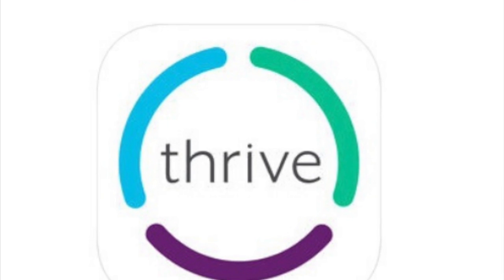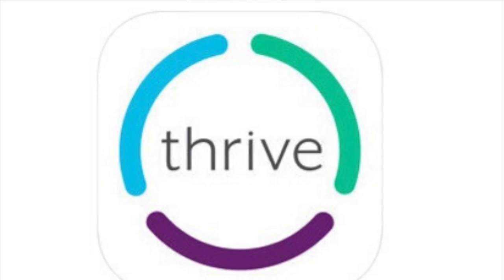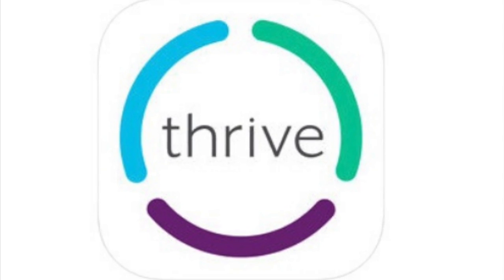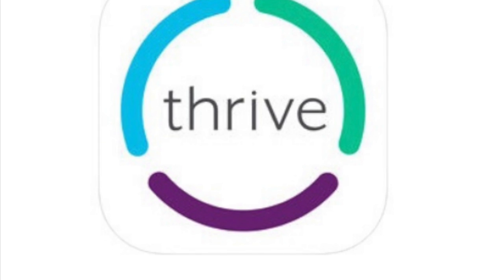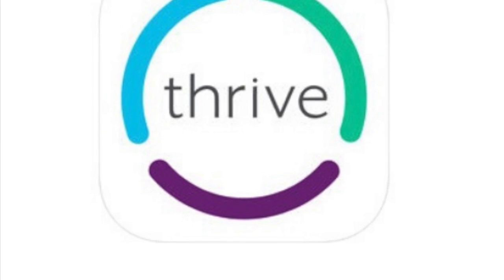In this video, we are going to talk about using the Thrive app to adjust your Livio hearing aids.